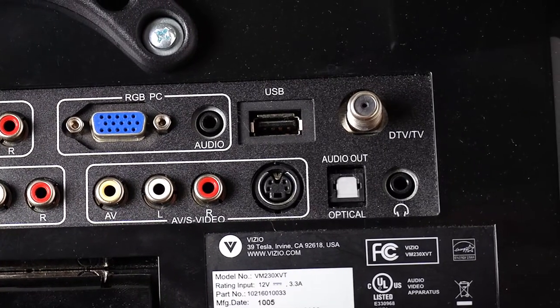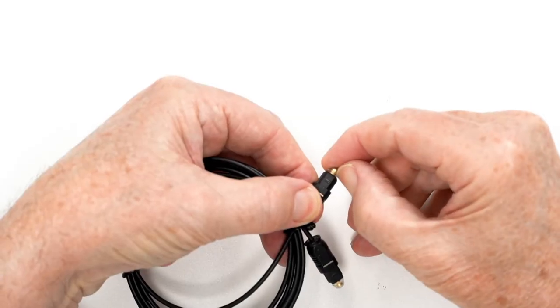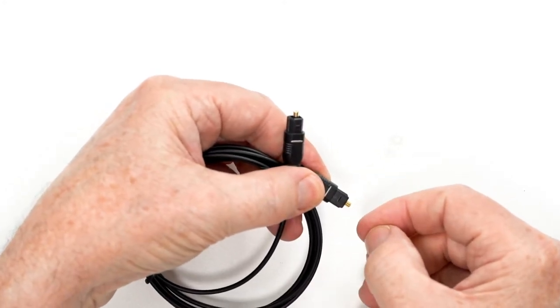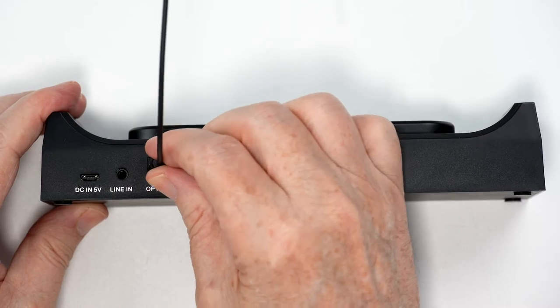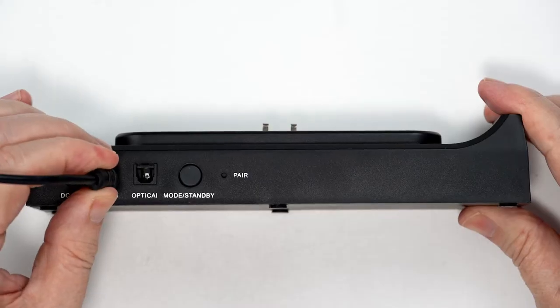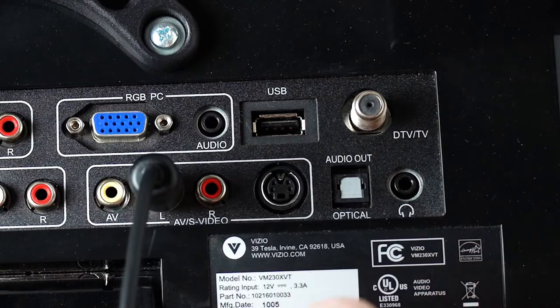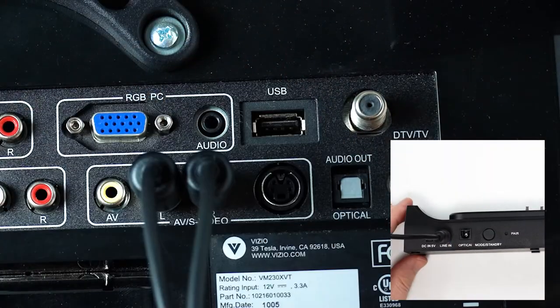Next, connect your TV speaker. If your TV uses an optical output, use the optical cable included. Remove the protective caps from both ends first, and connect one end to your TV and the other end to the optical port on the charging station. Or you can connect using the 3.5mm cable from the TV output to the line-in port on the charging station. If your TV has RCA connections only, you will need a 3.5mm to RCA adapter.